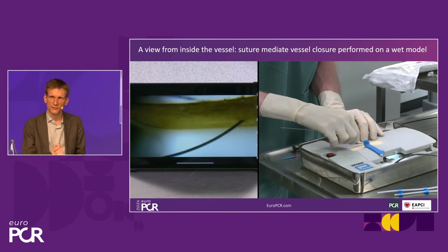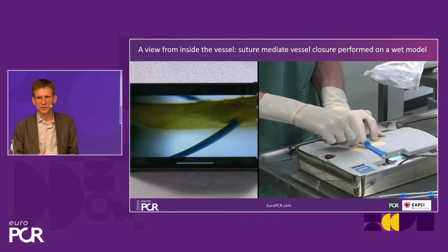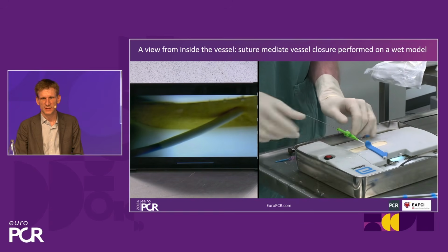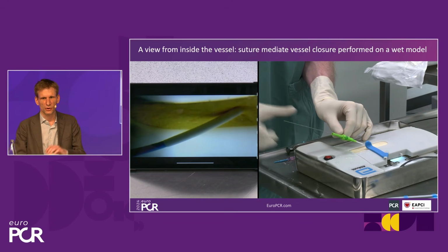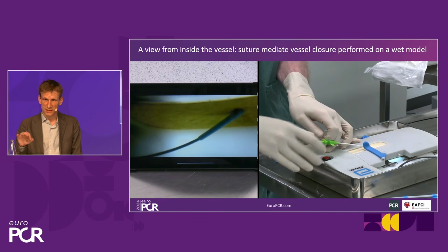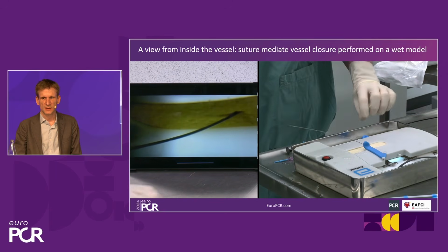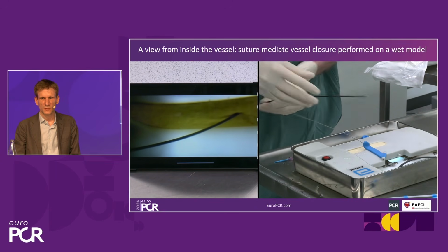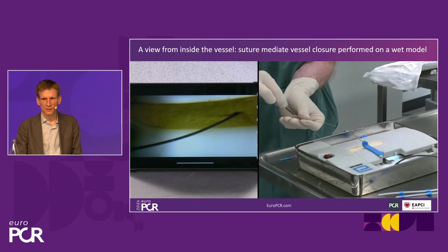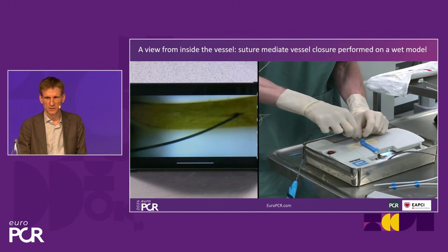It's important that you predilate the trajectory, the channel, with just a 6 French sheath. So that's what we hear here. It's a little bit more resistance than in real life. It's kind of a gummy tissue there, but I'm pulling back now. So it's important you make your skin incision, go in with a 6 French sheath, you keep your wire, you compress at that moment. Then the device will come in. Of course, in real life, you're compressing in the groin now, because otherwise it will bleed.